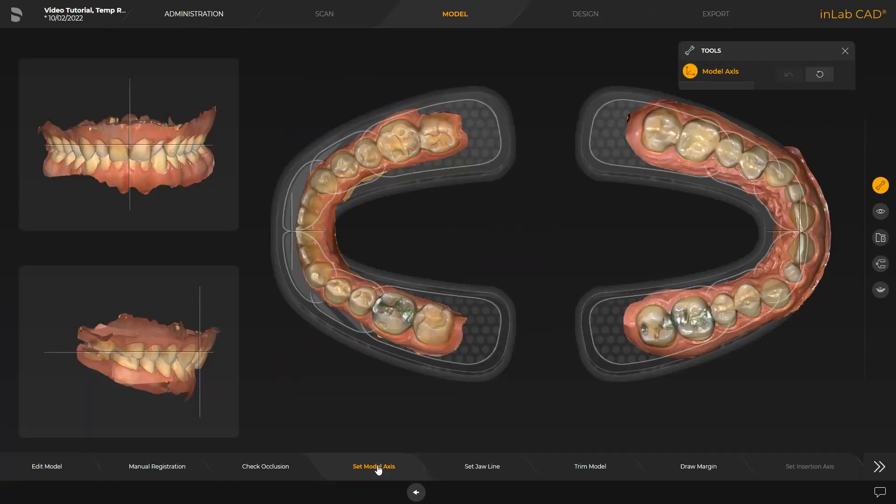The Model Axis is automatically suggested by the software. If necessary, modifications can be performed in the three views. The alignment is needed for the calculation of optimum initial proposals. This also applies to the next step, Set Jawline.